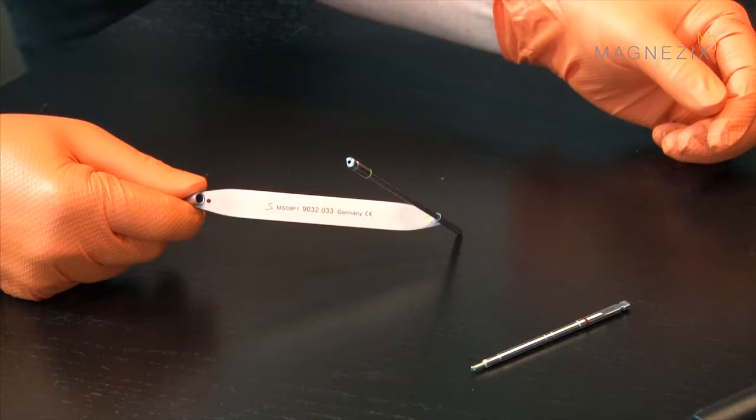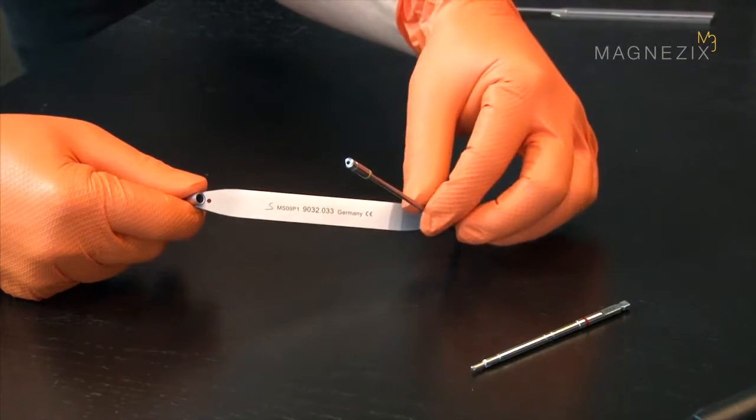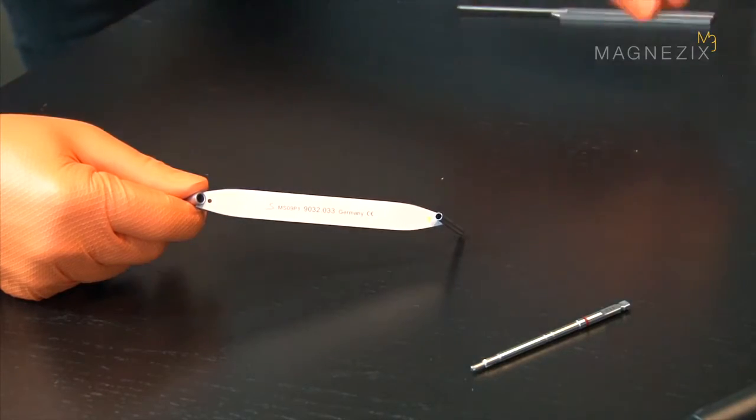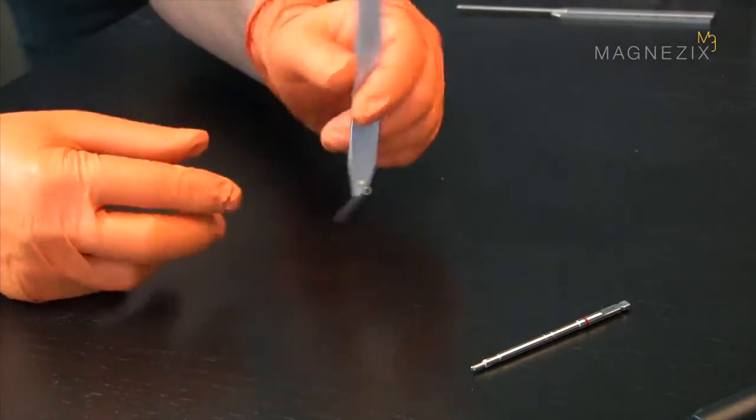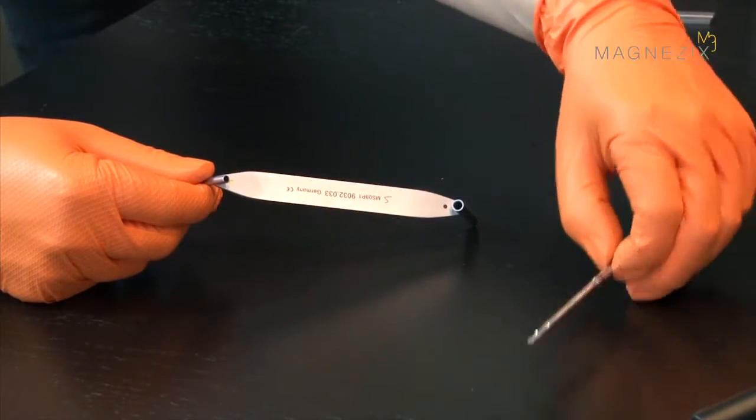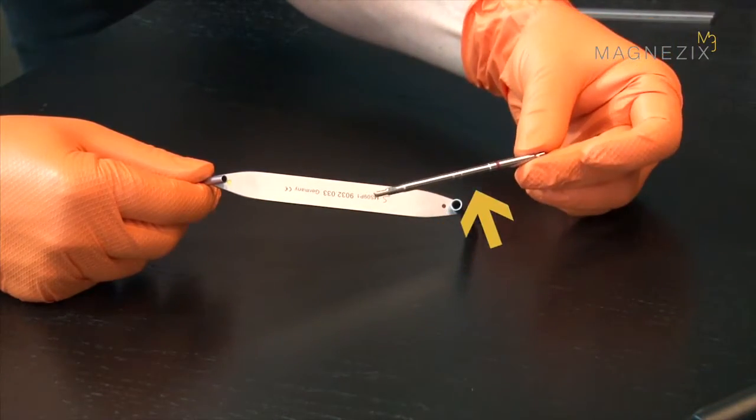To make it easier to insert the screw head, use the countersink to enlarge and bevel the point at which the head of the screw will sit flush with the bone surface, meanwhile making sure that the guide wire is still in place as you do this. Make sure you use the correct color-coded tools here.